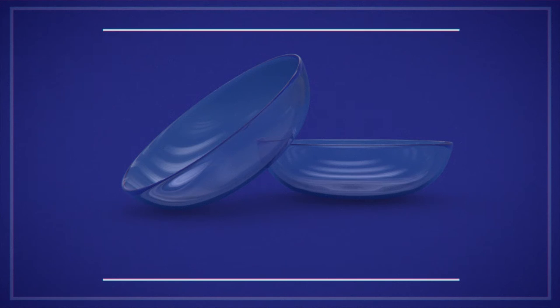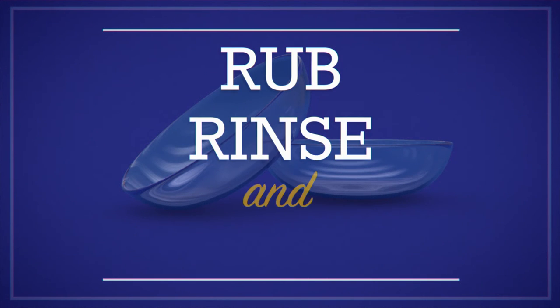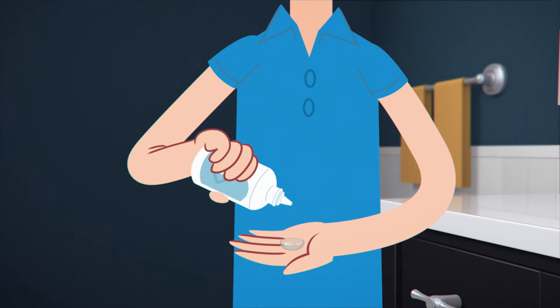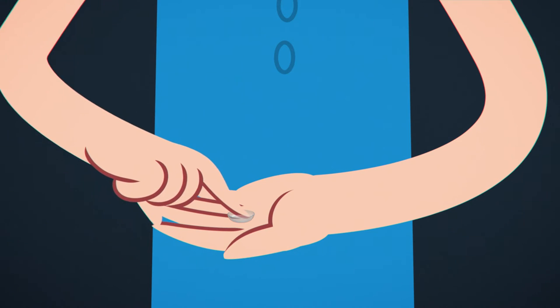When cleaning your lenses, remember: rub, rinse and soak. First, rub. Squeeze a little solution onto your lens and gently rub your finger back and forth over the lens for about 15 seconds.